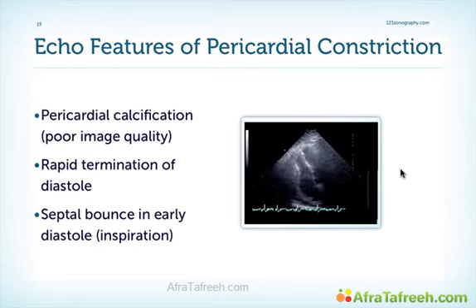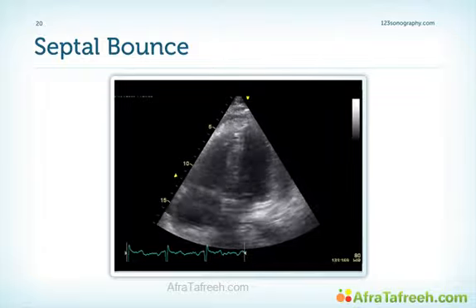Take a look at this image of a patient who has pericardial constriction. Note how the ventricle fills. All of a sudden, we have an abrupt stop of outward motion of the myocardium. In addition, you can see that there is an abnormal motion of the interventricular septum. This is the septal bounce. Also take a look at the contour of the right ventricle here. You have the impression that there is an indentation here, as if a calcified clamp were sitting here which constricts the right ventricle. It's often quite difficult to really see the features of constriction such as the septal bounce.